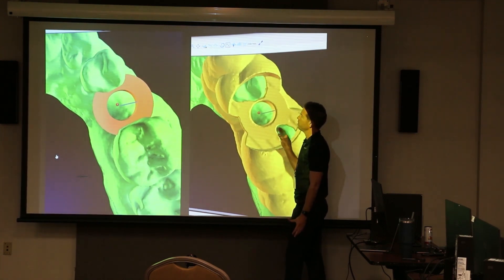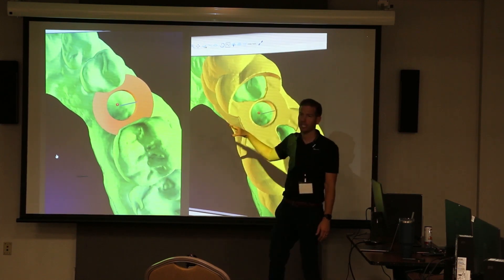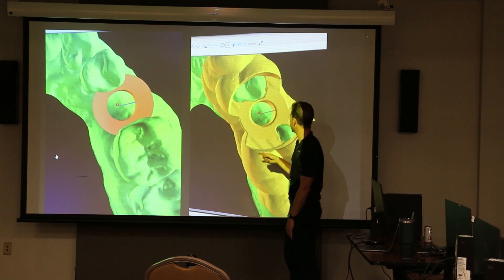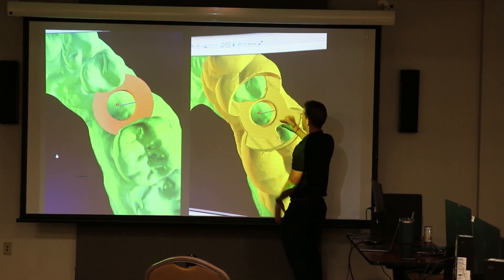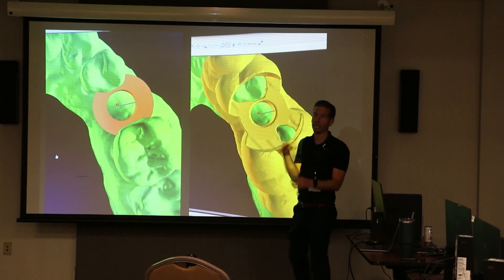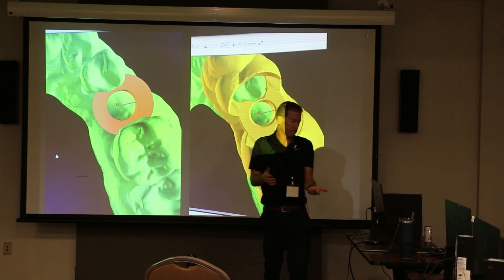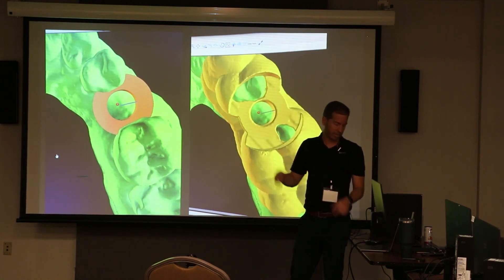After you create your surgical guide, go hide the guide tube and see what you actually got. You can check — am I too thin right here? If so, maybe move things just a little bit distal to steal material from one side and add it to another. It's easy: just click delete surgical guide, move your guide tube a little bit, and hit recreate guide. It's not a big deal if you create it and don't like how it looks — just delete it and recreate it.